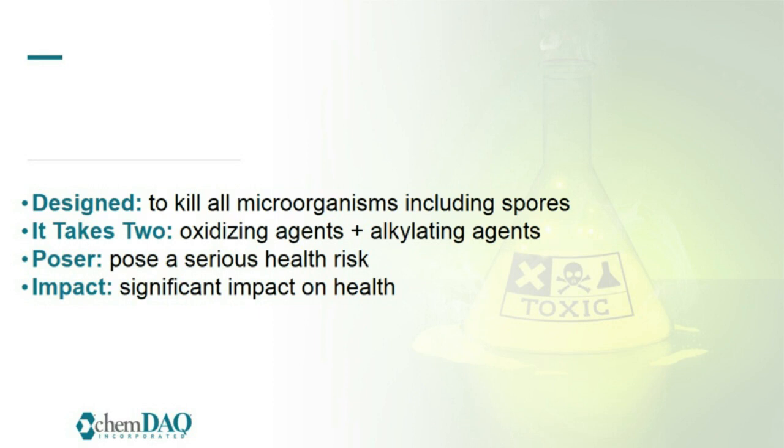So it's very important in your department to ensure that you have something in place to make sure that your staff know when they are in fact exposed. Next, the impact. We know that high concentrations and small leaks can have a significant impact on the health of your employees in the sterile processing department. Number two, sterilants pose serious health risks if you are exposed to them.